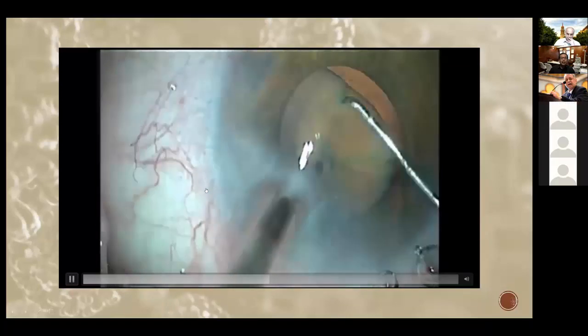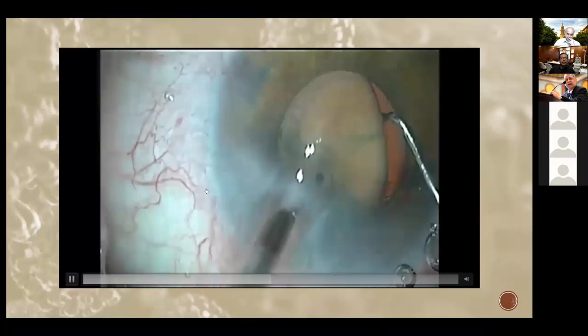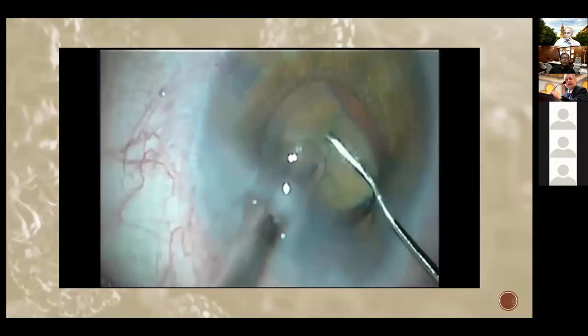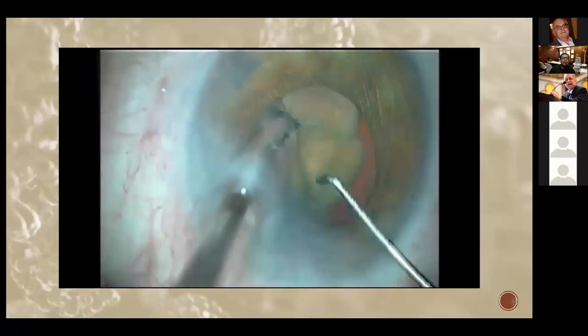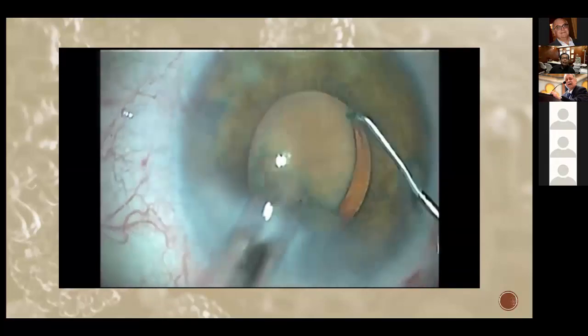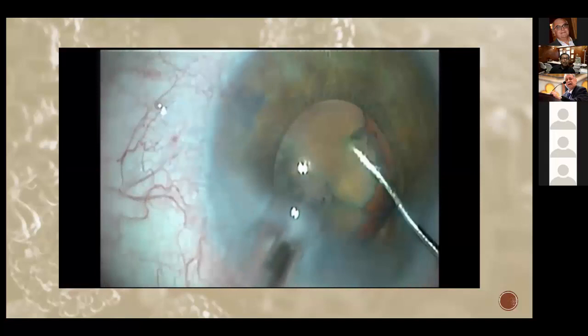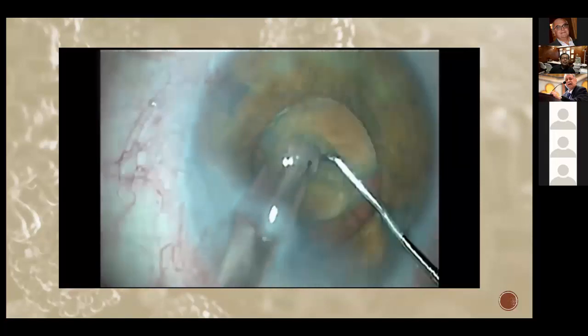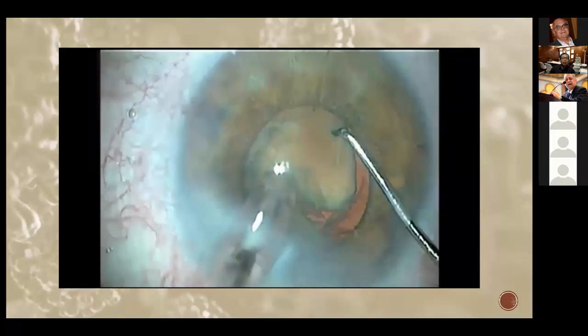The first chop, I found out it's not enough. So I go into a different place and I try to appreciate the thickness of the nucleus. I don't know if my phacotip will penetrate or not. Now when I chop, I can see how thick the nucleus is. So I can adjust how much I bury and how much vacuum I can use to bury myself inside the nucleus. Now I can see the thickness of my nucleus. So now my chopping is better.